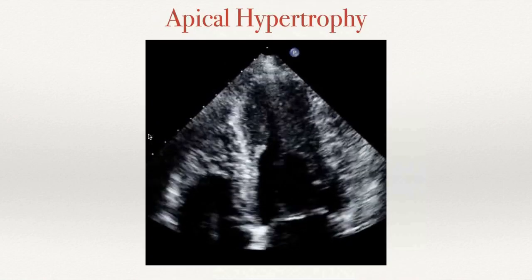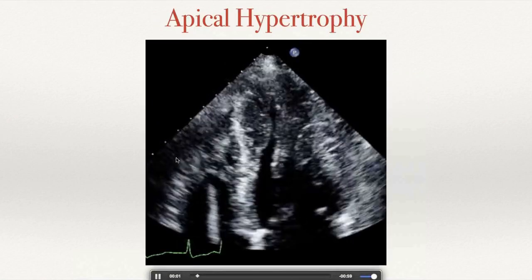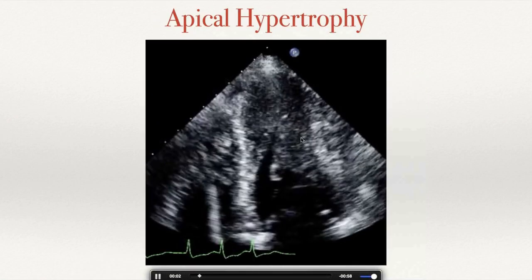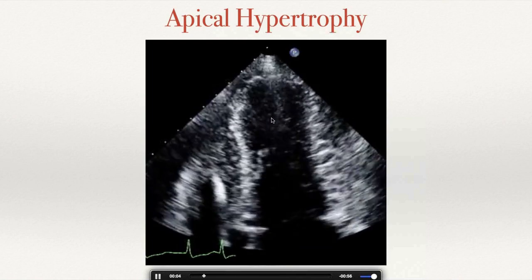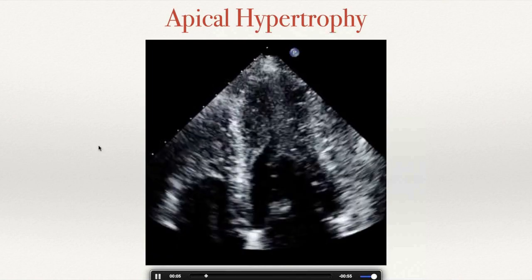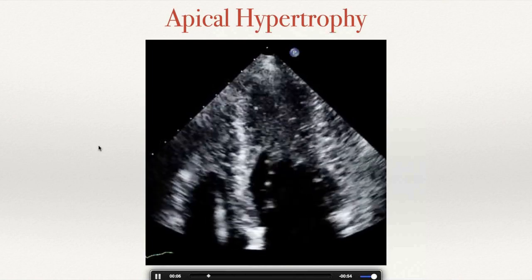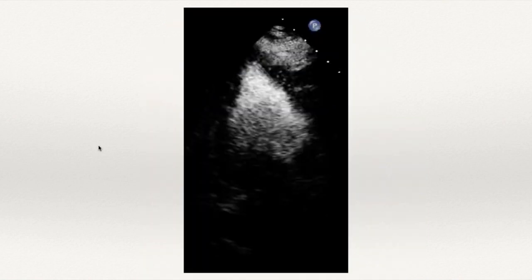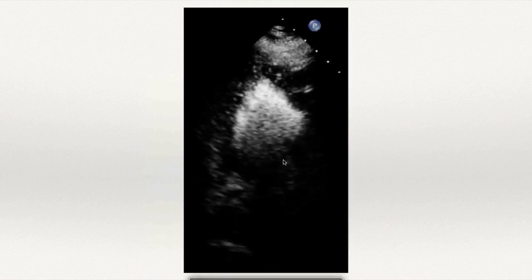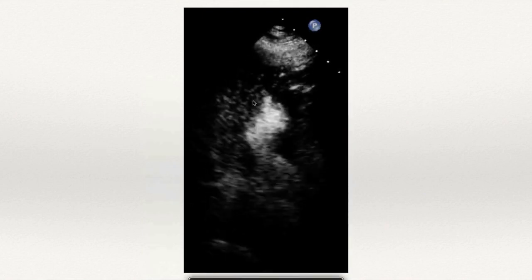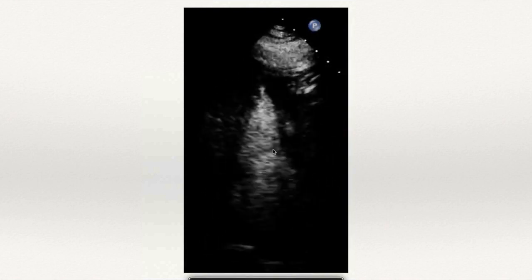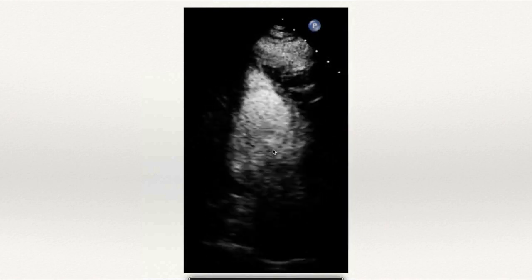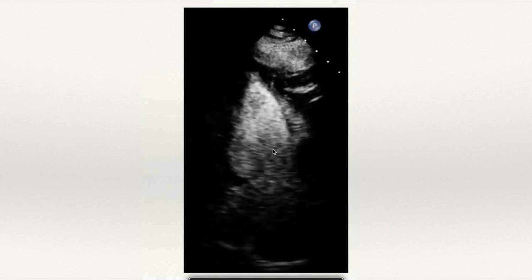This is apical hypertrophy — one of the more obvious cases where you can clearly see the apex is hypertrophied. When you add contrast, you can sometimes have obstruction at the level of the apex, which traps the contrast there and gives you what we call a spade sign.